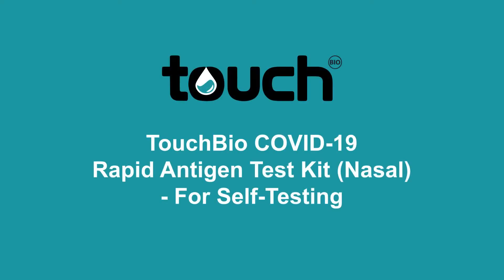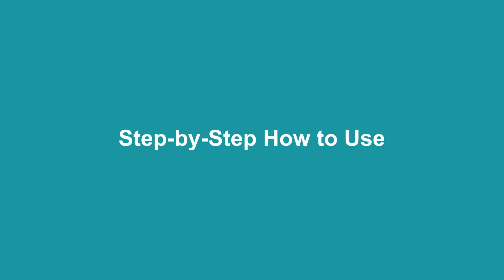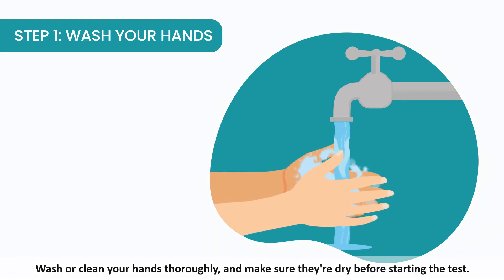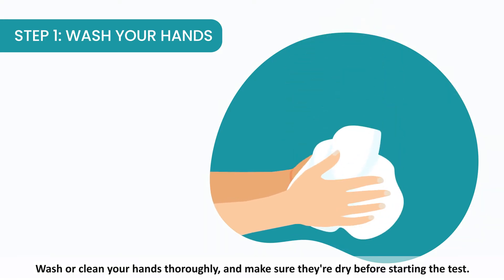TouchBio COVID-19 Rapid Antigen Test Kit Nasal for self-testing. Step 1: Wash your hands. Wash or clean your hands thoroughly and make sure they're dry before starting the test.